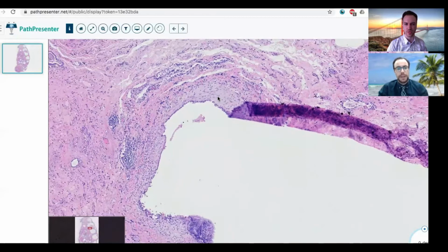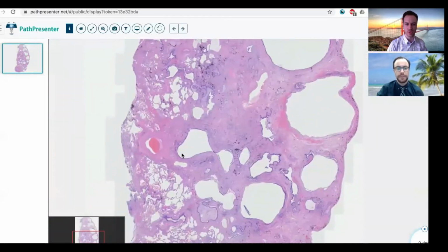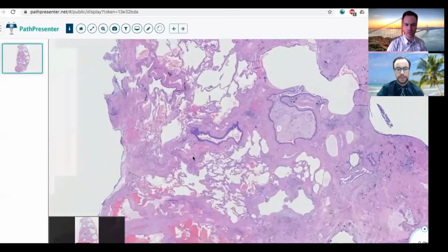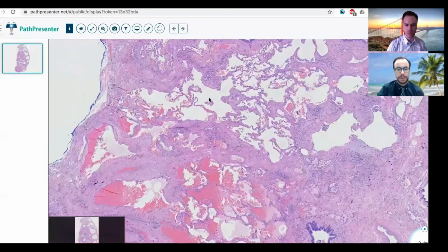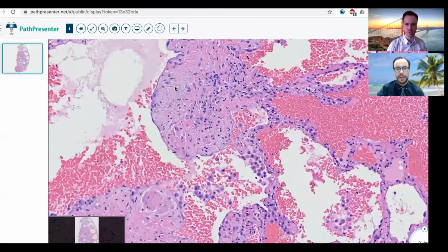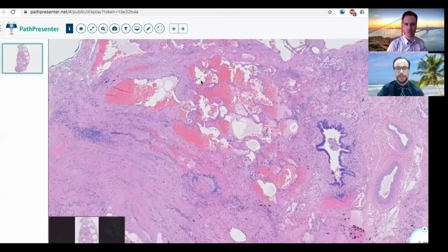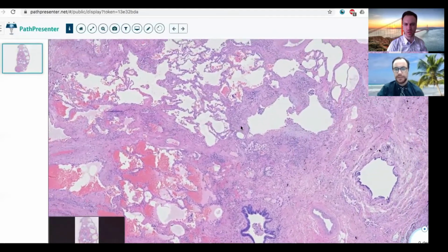Good job. And I think there's actually a really nice one often at the interface down if you move to the bottom left. Okay. So I think there's one. Yeah. Small one here. Yeah, I think there's one more if you zoom out a little bit and move to your right a little bit. Yeah, so I think there's actually two right there.